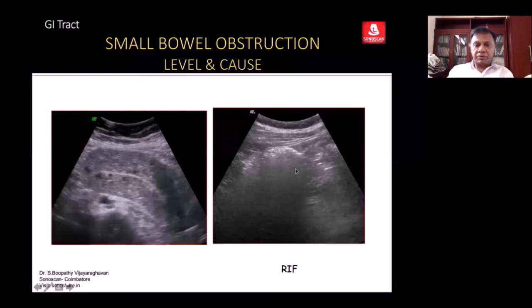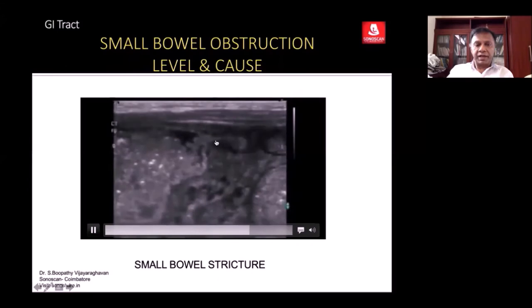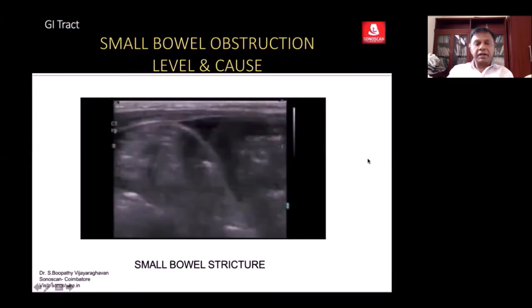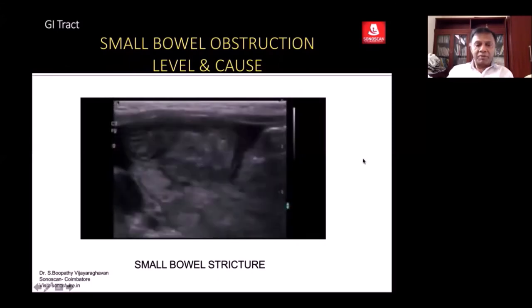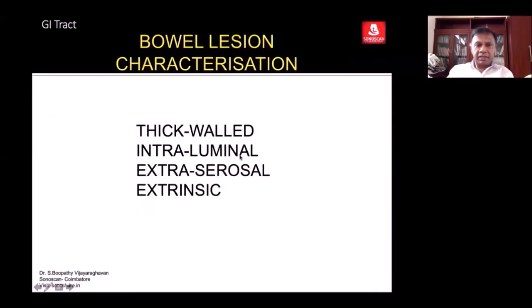In the right iliac fossa, if you don't see dilated loops and you see a normal appearance of the cecum, the obstruction is somewhere in between — it may be in the jejunum or ileum. You diagnose it when the lumen suddenly stops and you see a narrow lumen with short segment thickening of the wall, which is a small bowel stricture. You may also see a very thick adhesive band, followed by a collapsed loop with the bowel signature.